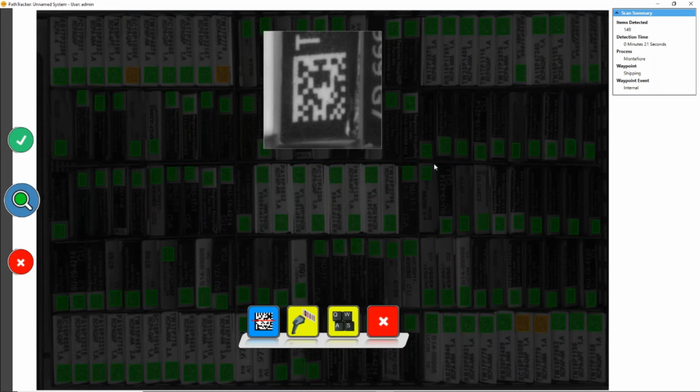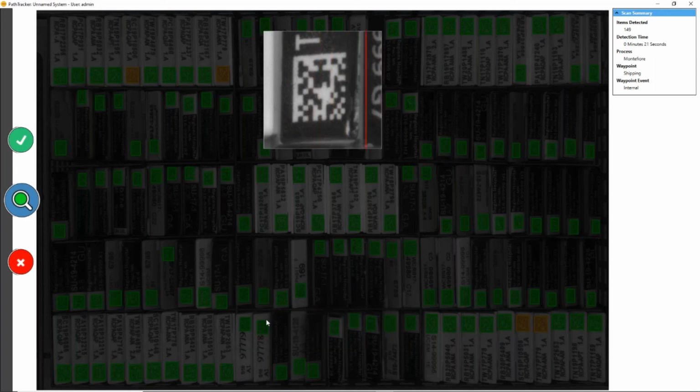You click on it, and you're presented with this screen here. And you have a number of different options to recover the barcode. The simple, most obvious option is the first one, and that's what we call our intensive scan option. And that really looks hard trying to recover the barcode. We can't do this on the whole image because it would take a very long time, but on this small area, it's not a problem. I do know that this won't work because we won't recognize the inverse barcode, but this is what it looks like.